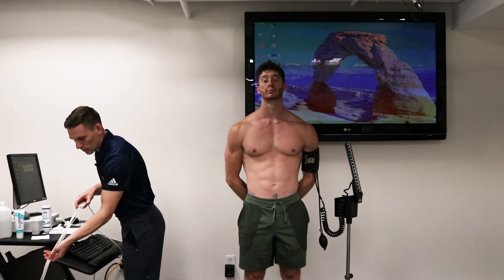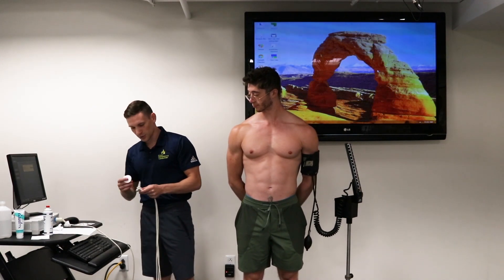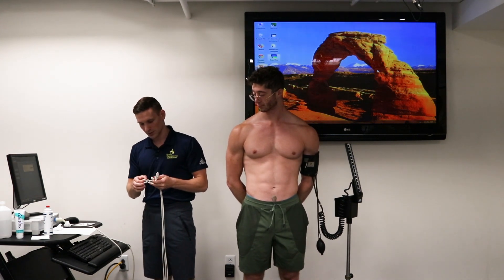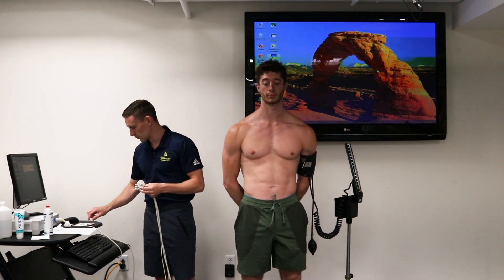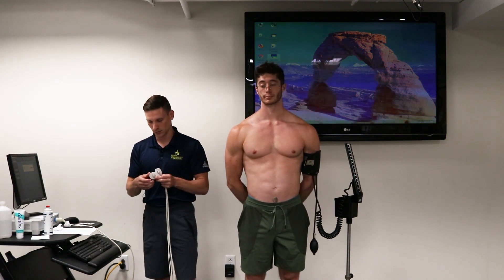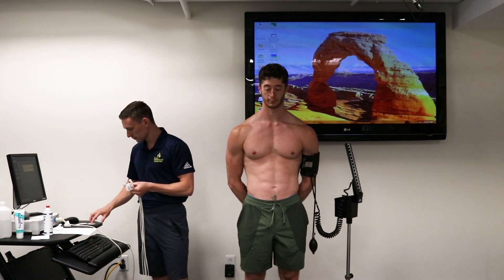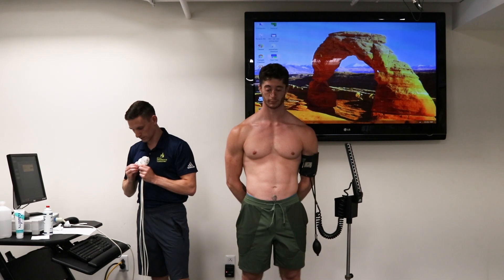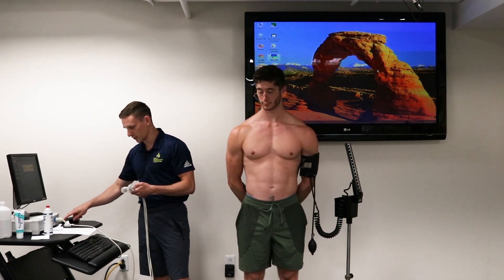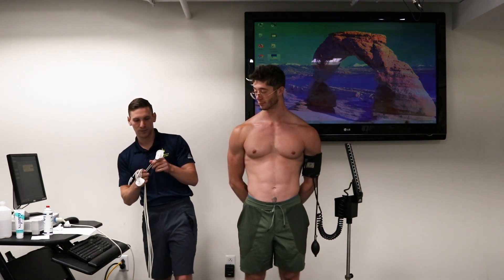The next thing we're concerned about is attaching the electrodes to the leads themselves. It's good to put these on before attaching them to the patient, because it's a little hard to push them on and that could be uncomfortable, especially on the neck. As soon as they're all on, you're going to hear a nice click for each one. Then we can get started with our application.